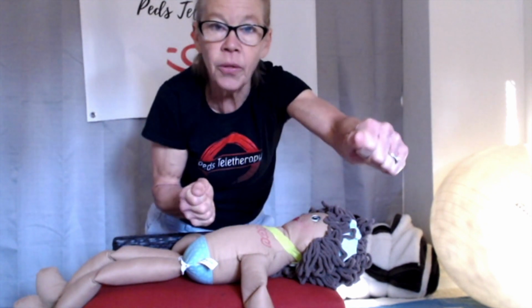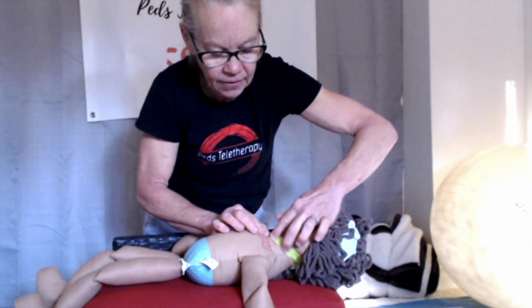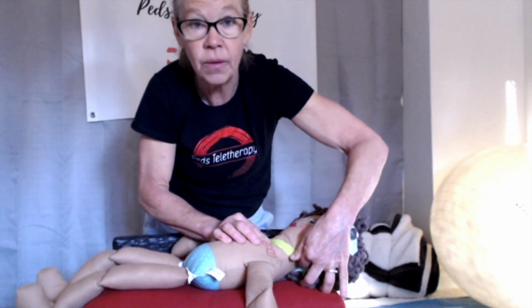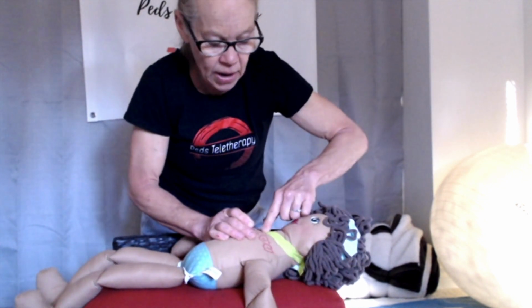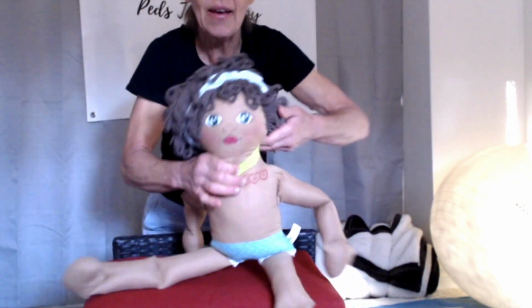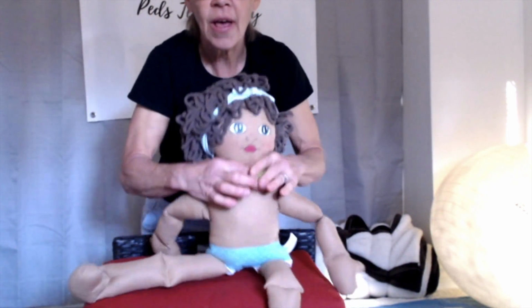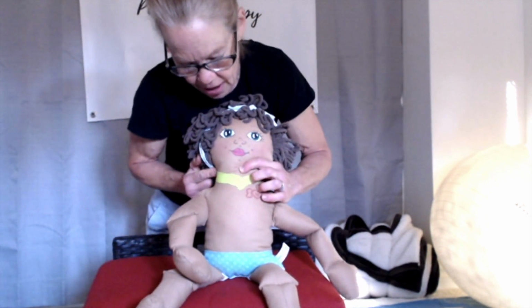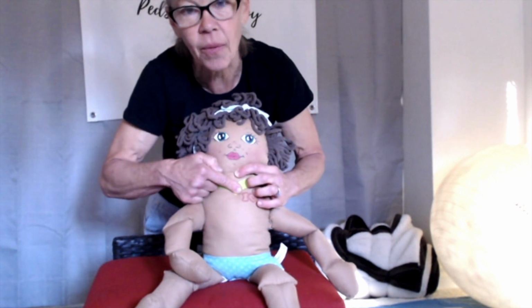You're not pulling with all your might. You're just doing a nice gentle pull towards that insertion. And again, why did I start here? On. I want the left side working harder. On the side I want relaxing, I actually start at the insertion and come down.